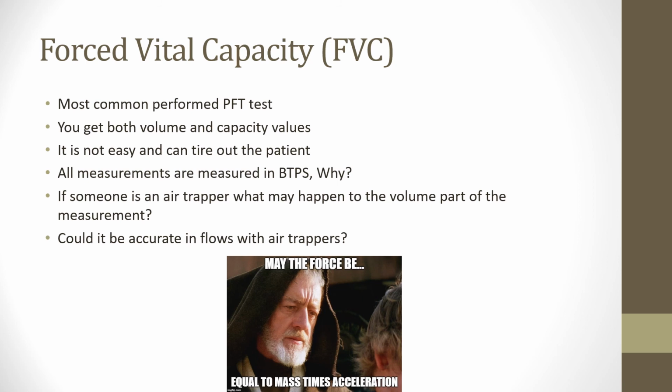Okay, the forced vital capacity. This is the most commonly performed pulmonary function test. This is the gold standard at the bedside of a patient. The doctor wants to see how severe their current lung process is for diagnostic and therapeutic purposes, so they order a bedside forced vital capacity. So you'll go into the patient's room and you'll do this procedure.